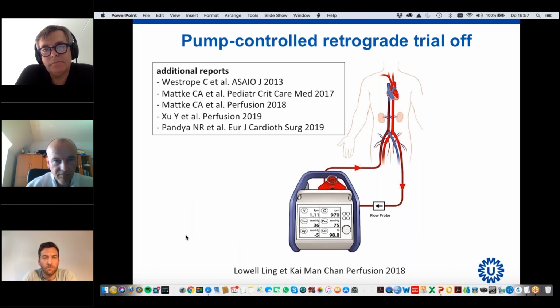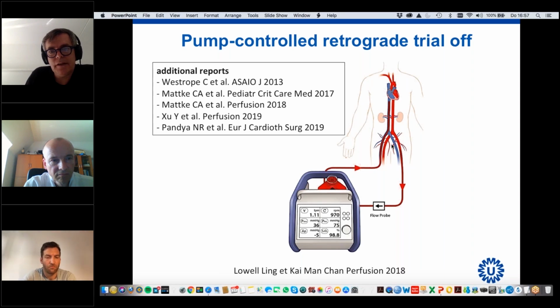We do not have much experience with that. We have tried that a couple of times, and it is feasible. What is done is that you turn around the flow. So you actually let the patient pump through the ECMO circuit in the opposite direction of the support mode. In that way, you have a possibility to evaluate left ventricular function and systemic circulation of the patient, but also the right ventricular function. And you can tailor the pump speed to the need of the situation.